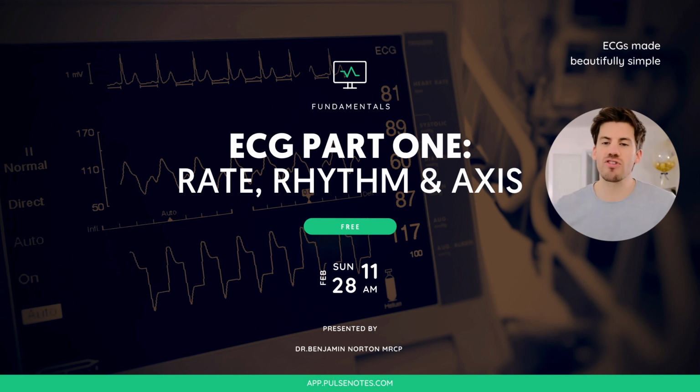Through each of the lectures, we're going to build on more and more parts of the ECG, culminating in the final lecture where we're going to do lots of practice. Today we're going to be looking at a bit of electrophysiology, some of the basic components to help us interpret, and then we're going to start practicing through these different elements of the ECG.